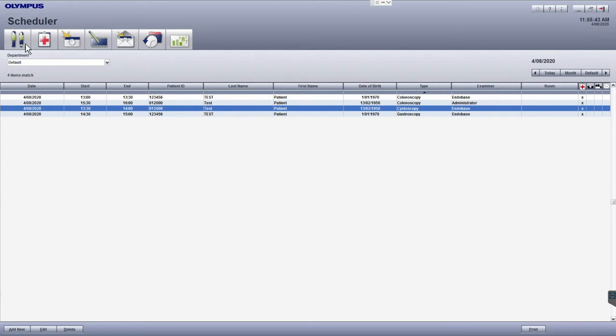At the top of the screen you will see the module icons which we navigate from left to right to complete the documentation workflow.